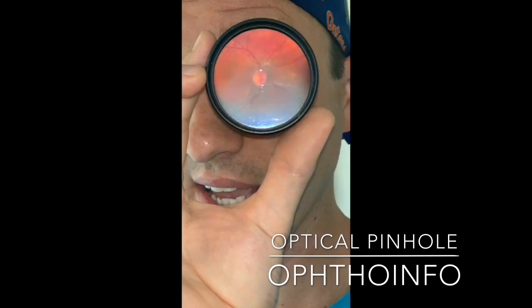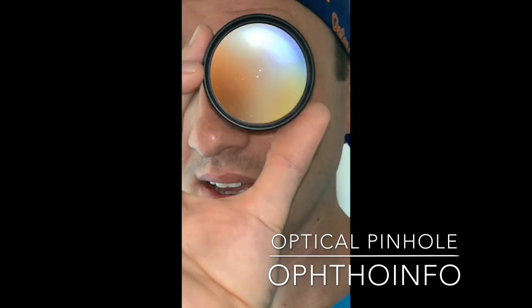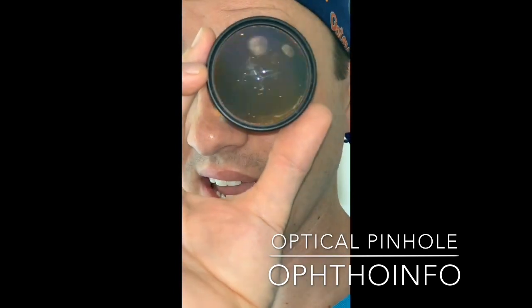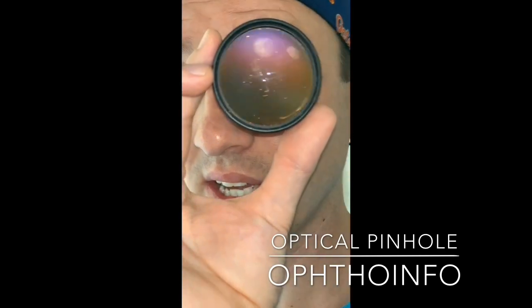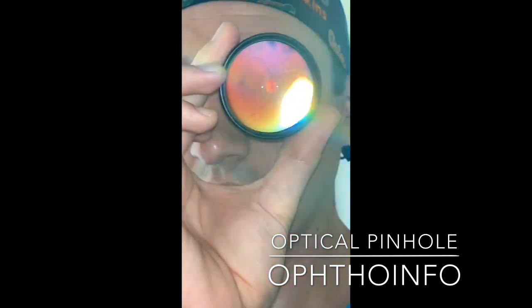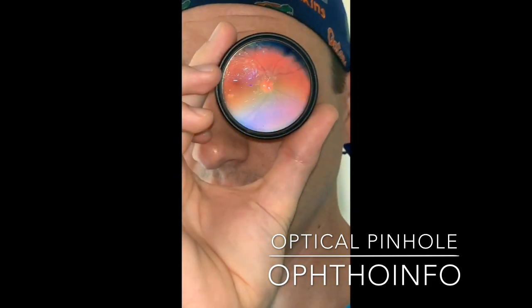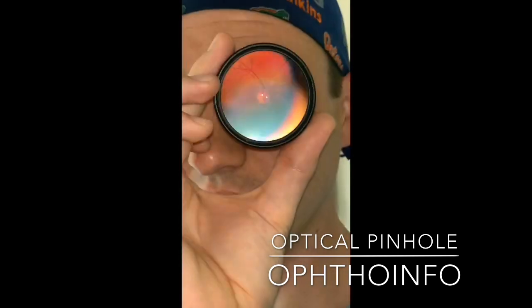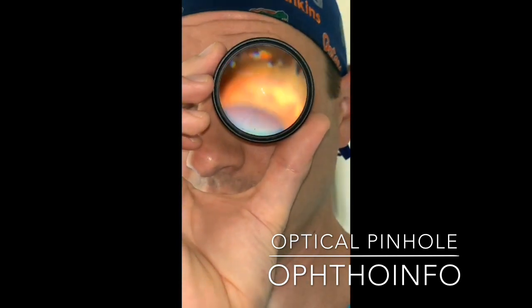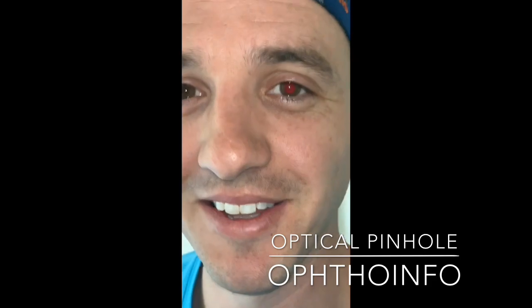Now you know why you can't see the fundus with the indirect without the aid of a 20-diopter converging lens. And what's the answer? Well, the answer is you actually can, so long as you take out the plus-two cheaters and you get real close. This takes some practice, particularly to do it on yourself, but you learn how to do it on a patient relatively quickly. Just try to do it each and every time you see somebody in the ER and you'll get a handle on it in no time — and be sending pictures to your seniors and your attendings. It's huge.